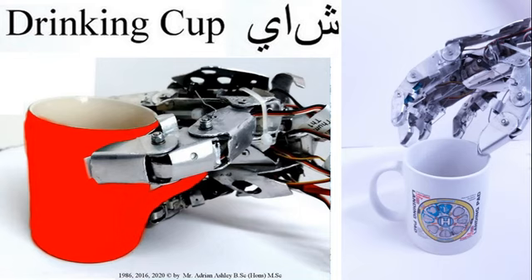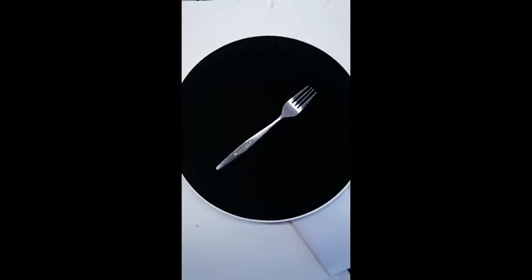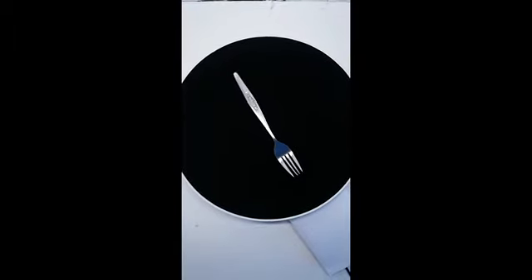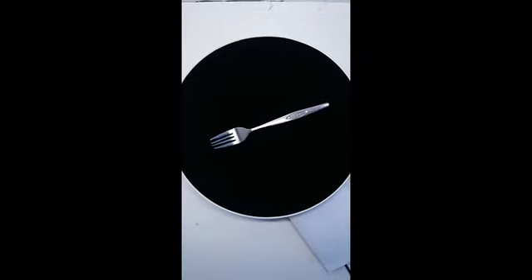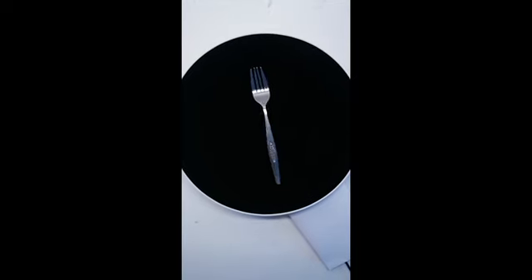If the prosthetic hand recognizes a drinking cup and detects the temperature, then the system could handle the physical manipulation of using the cup safely and reduce the workload for the user. If the system was able to recognize a knife, a fork, or a spoon, these utilities are different and are used differently. The robotic prosthetic hand should operate in a manner to suit the identified objects.